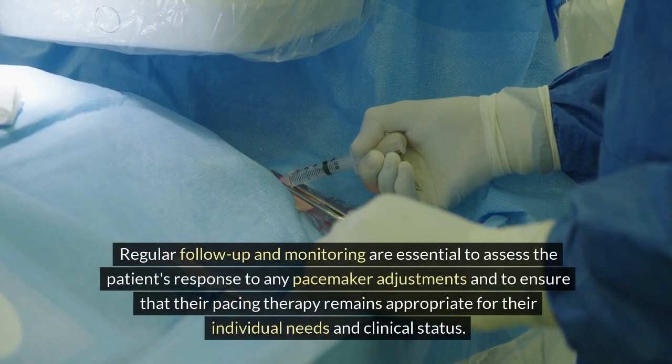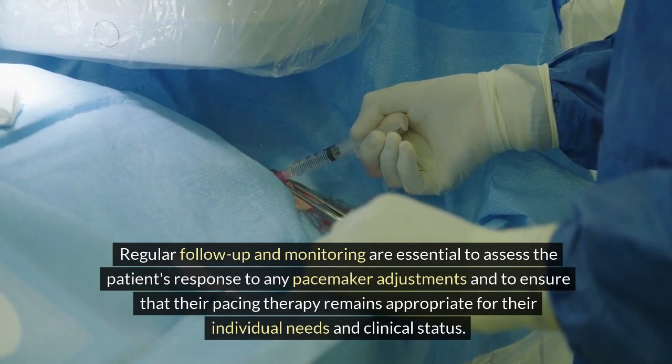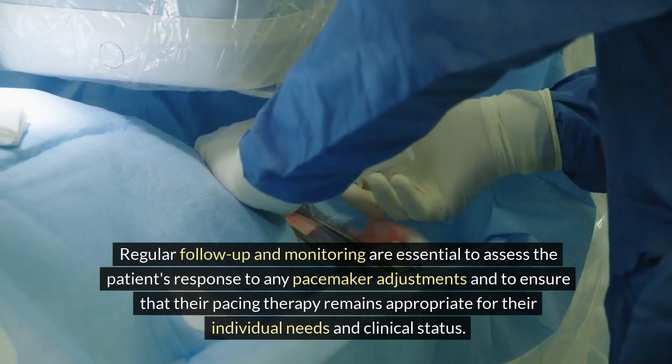Regular follow-up and monitoring are essential to assess the patient's response to any pacemaker adjustments and to ensure that their pacing therapy remains appropriate for their individual needs and clinical status.